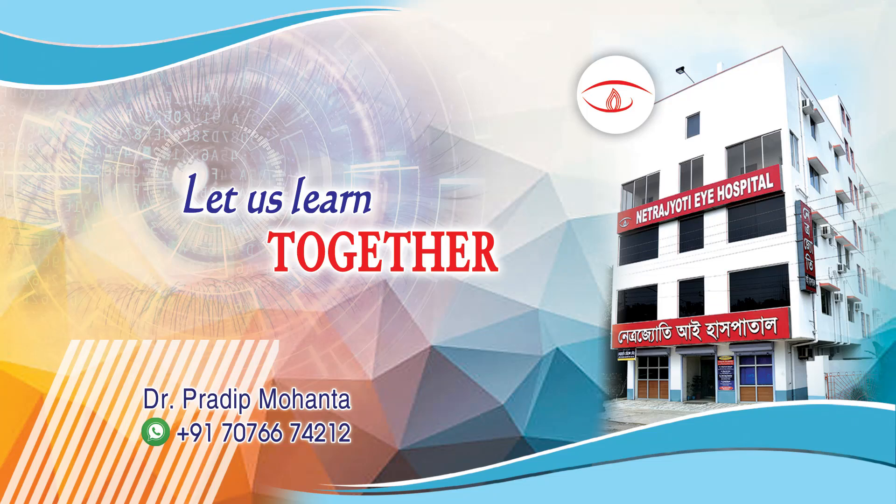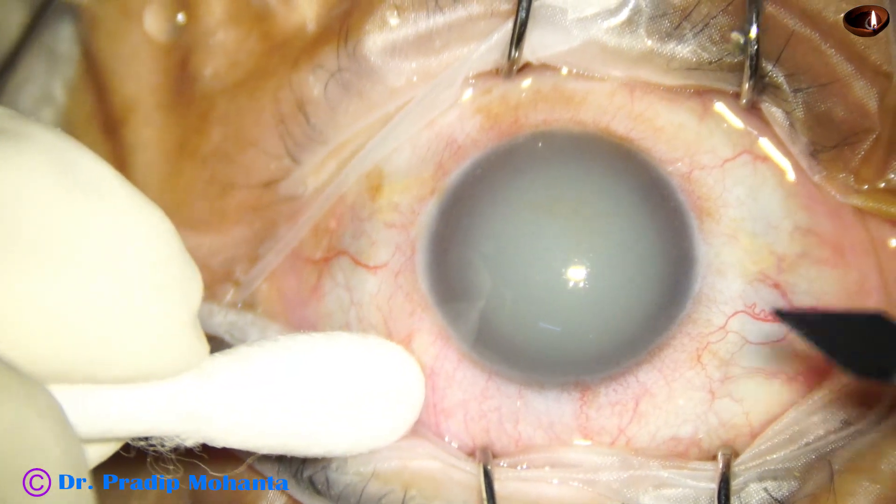Welcome to my workplace at Ranaghat, West Bengal, India. Let us observe this minimally edited surgery.